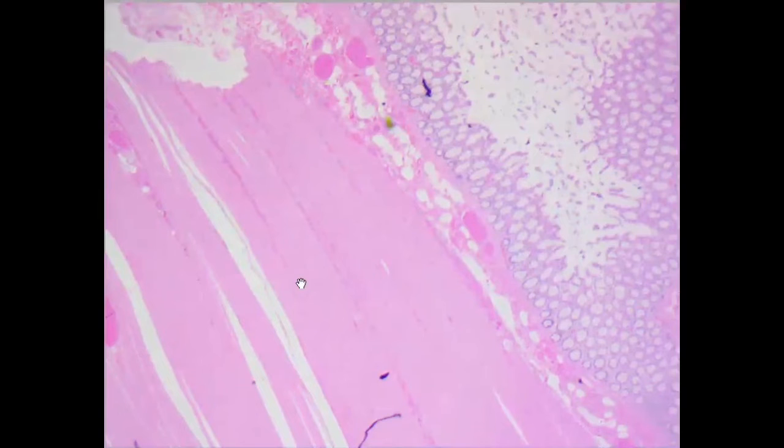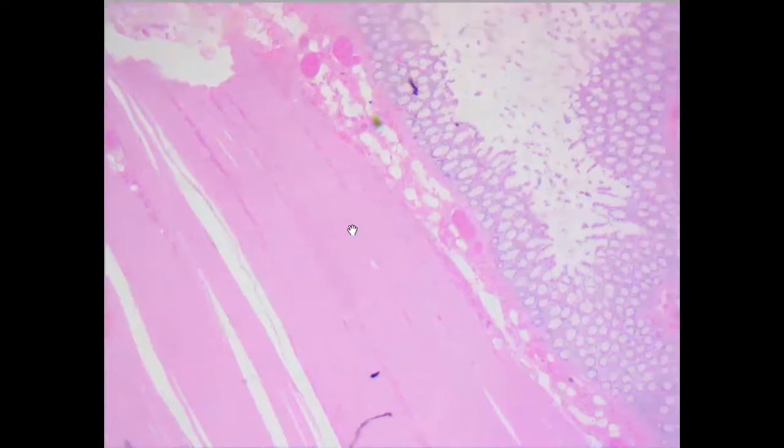These are the layers of the gut, and we have here the mucosa, we have the submucosa, and this is the muscularis propria. You can see how big it is. Okay, and let's see how far this mucosa and submucosa will go down. So now they started to penetrate into the muscularis propria. It's on both sides, and they will go deep until they penetrate into the muscularis propria. And this is what we call the pseudodiverticulum, or we call it a diverticular disease.